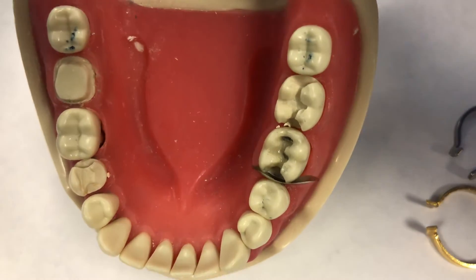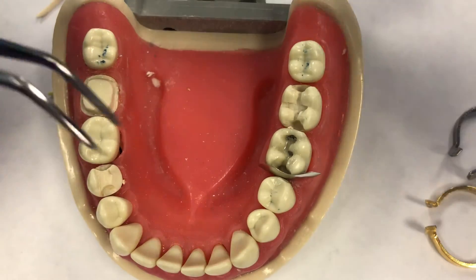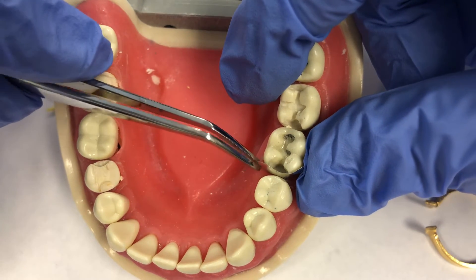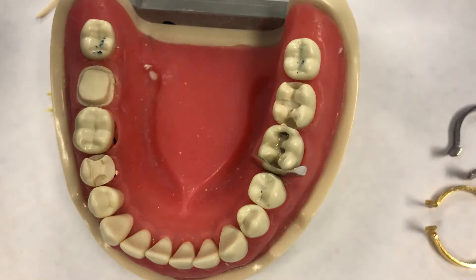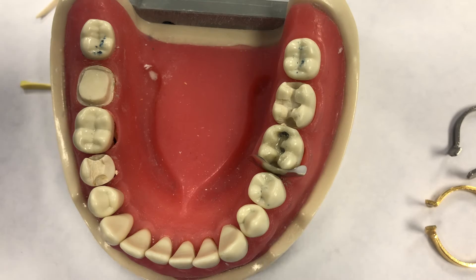You can see it's against the preparation. I'm going to slide it to the lingual slightly to even up the edge. Working on these models is a little more challenging, although it is easy because I don't have to deal with saliva, tongue, or cheeks. But the gingival tissue is a little rubbery and stiff. I need to secure this matrix into position — I'm going to use a wedge to do that.